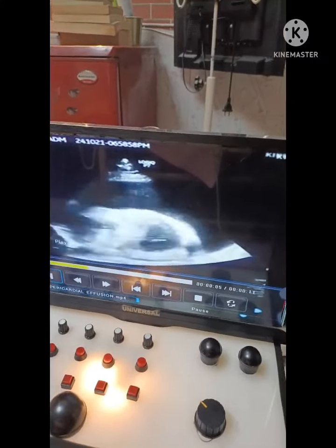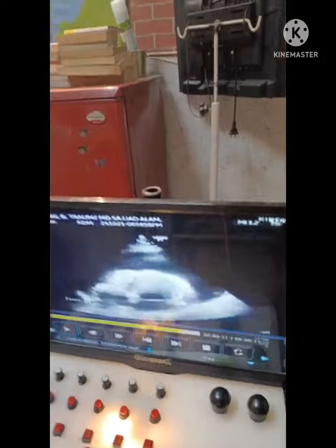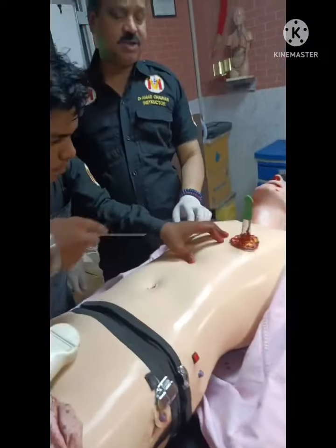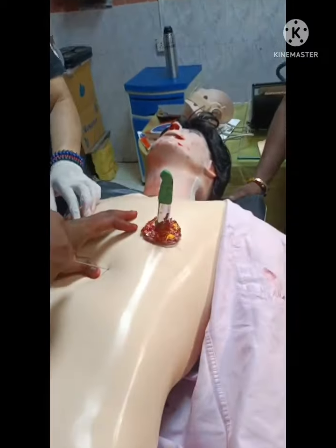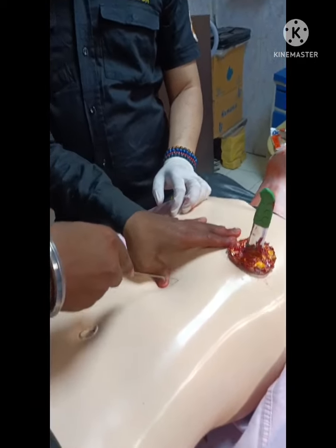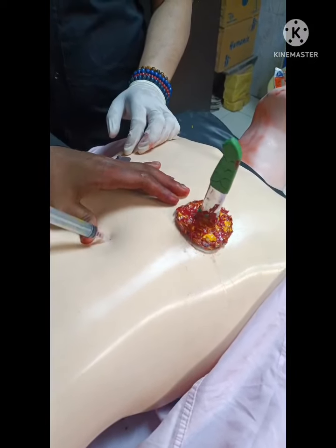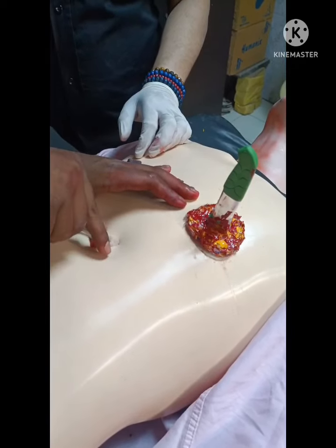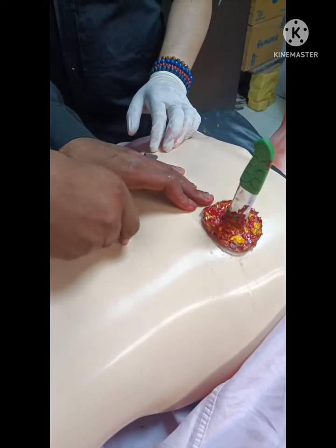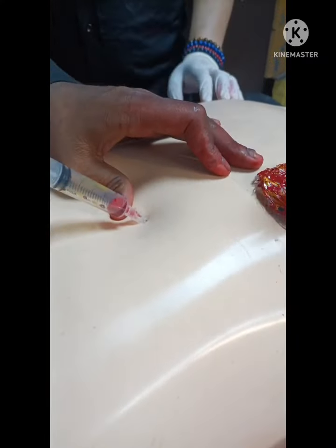This is a scenario for cardiac tamponade. Obviously, these patients need OR resuscitation, but to temporize the situation, you can do a pericardiocentesis. We have incorporated pericardiocentesis. Of course, this is a landmark-based pericardiocentesis, and whenever possible, ultrasound guided should be done. So this is how you do pericardiocentesis.